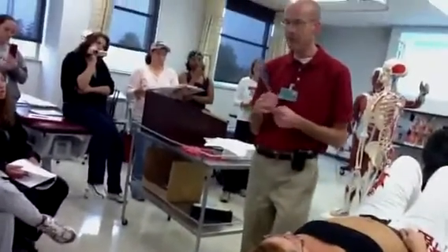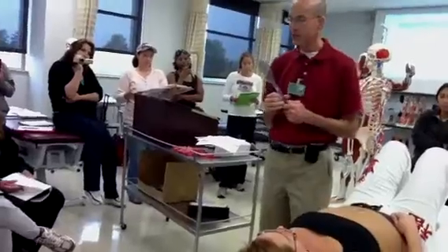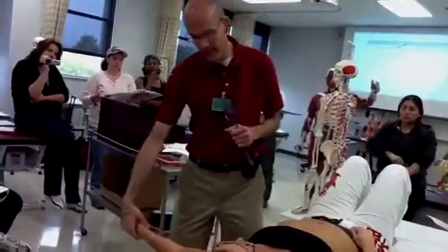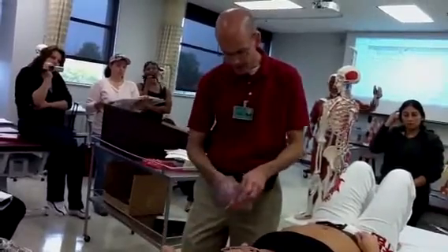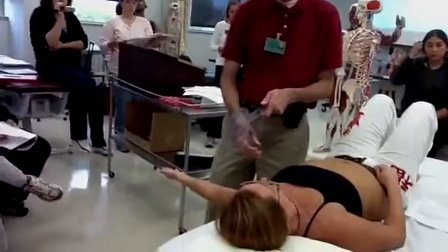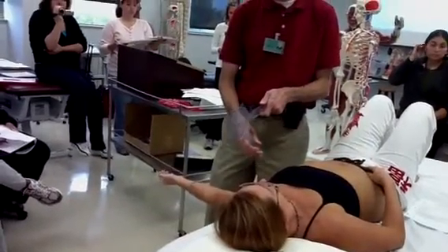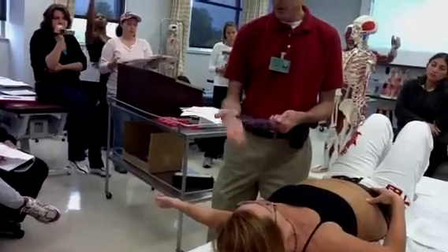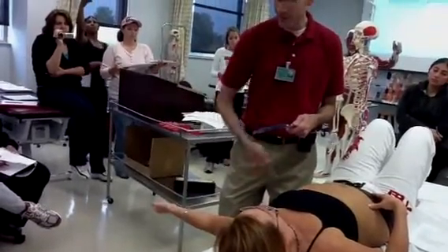Okay, and again, I think I've mentioned this to you before. I've seen students also freeze up because they're supposed to measure shoulder abduction, and they're trying to figure out how they're going to do that. And I've just seen students freeze up and can't figure out what to do here. What's the problem? Turn it. The goniometer needs to be in the same plane as the plane of movement.